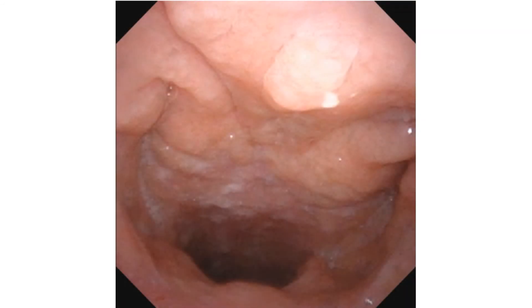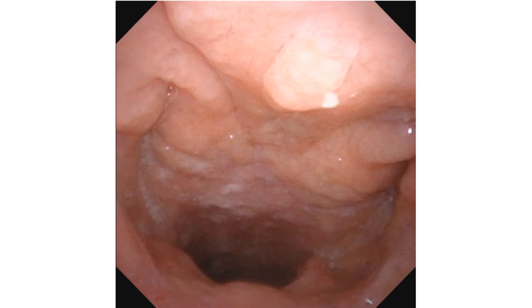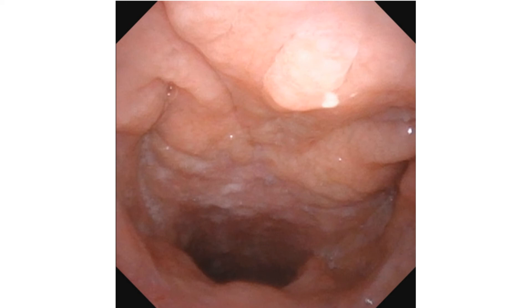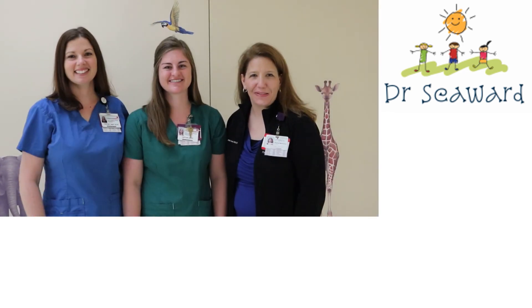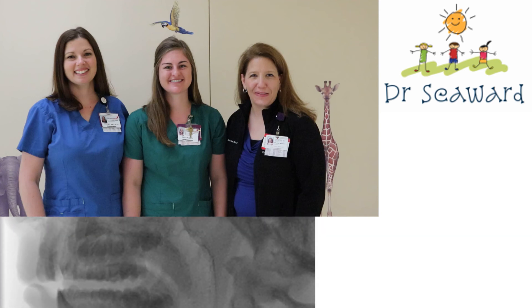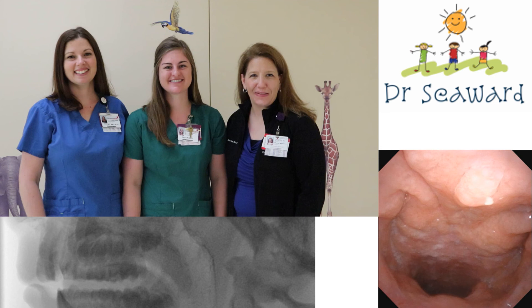This study is very helpful to show differences in palate movement between the right and left sides, and to show the speech mechanism in patients who have had a pharyngeal flap. For me, making a decision about whether a child would benefit from surgery for speech takes a team. The speech therapist evaluation is very important, and the information from the speech imaging — video fluoroscopy and nasendoscopy — shows whether surgery can help, and which type of surgery is most likely to help the individual child.